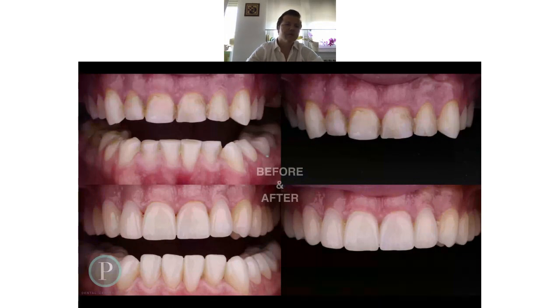You see on the before, tooth number 4.4, we produced here 4.3, 4.4, and 4.5 veneers. I just used the burr to show the margin to my technician, to my scanner, and I didn't prepare the vestibular occlusal part of the tooth. I didn't prepare anything.